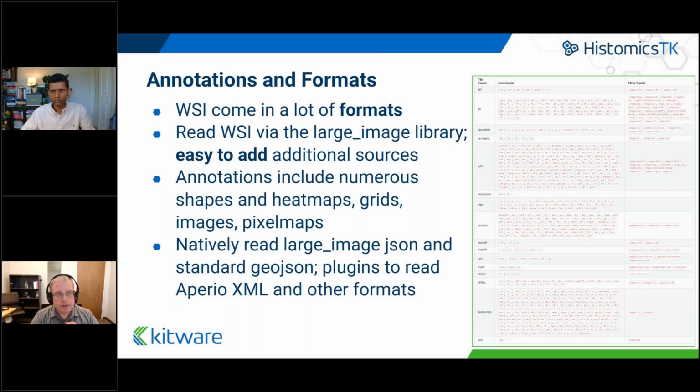And we use a variety of different libraries to accomplish this, so that we are leveraging other open source tools to make it so that we can read these things. So OpenSlide reads certain things very well, but not everything. And Bioformats reads other things very well, but not everything. And similarly, for efficiency, you might want to read TIFFs directly with libTIFF. So all of that is transparent to most users. They just know that they upload a file, they can use it.